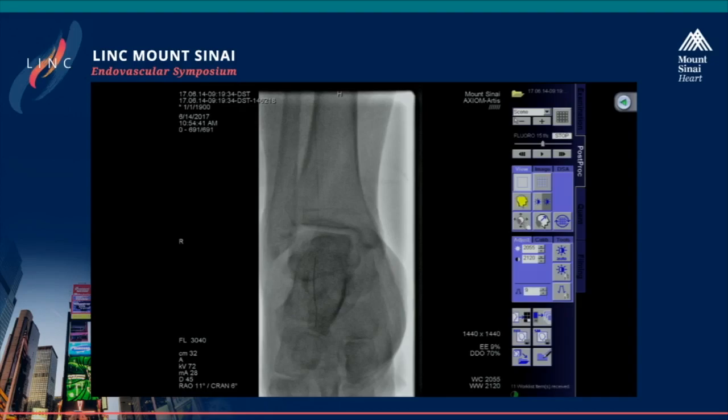As you saw, I don't know if you noticed, there was a little pop that occurred that allowed the wire to find that lumen. Once we got into that softer area or that hibernating lumen, we were able to advance it. But the key here is to make sure that you actually advance your catheter. A lot of people are worried about using 035 catheters. I mean, we've learned from Andre and other people that 035 catheters really work well below the knee. Right. And, especially you cutting it or shaping it to help you.